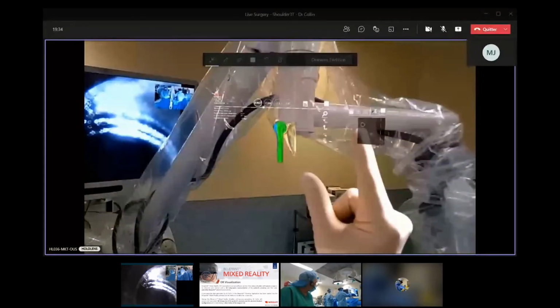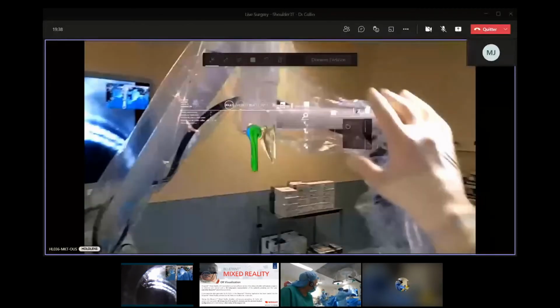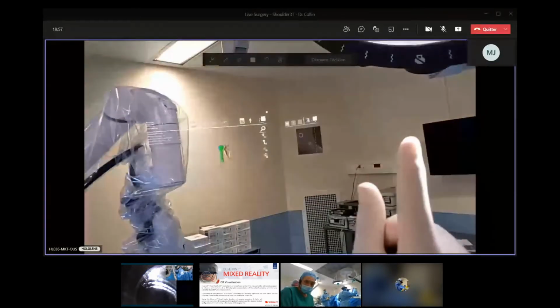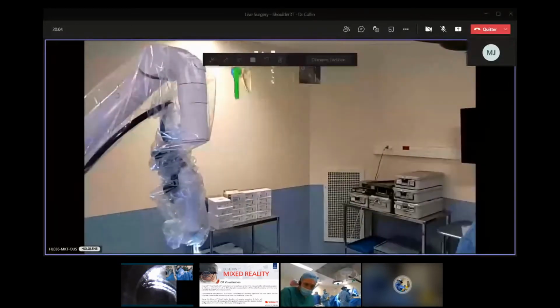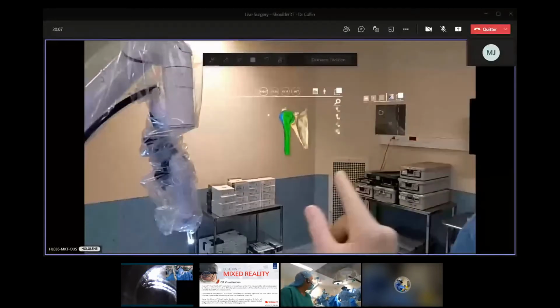Of course we can. If you want to, you can do this. I need to have it here. For me, it's perfect. Voilà. It's okay for you? So you see the anatomy? You can take it, it's very easy.